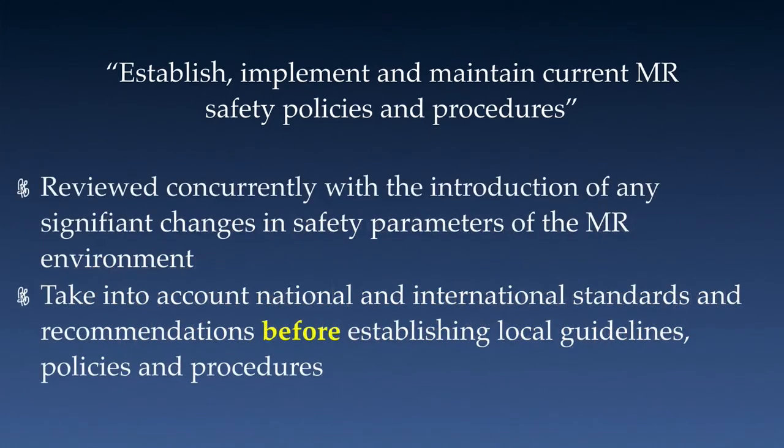These should be reviewed along with the introduction of any significant changes in safety parameters in your facility. For example, you have a new magnet, you have a new room, you have a new area, you have an upgrade to the gradients, you have an upgrade to the RF. So anytime any of these changes are made, that's a good time to review your policies and procedures.